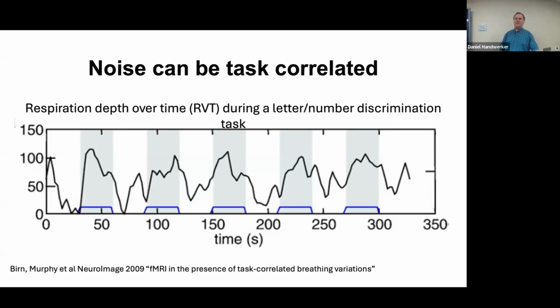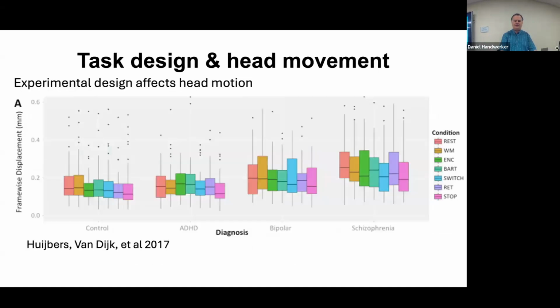I also mentioned in my talk two weeks ago that I had this data set where I was showing a stimulus for 1, 3, or 6 seconds. And there were certain volunteers who held their breath as long as the stimulus. There was nothing I could do. There's absolutely no way I could have solved for that issue. And that's never the fun answer, but it's sometimes the answer.